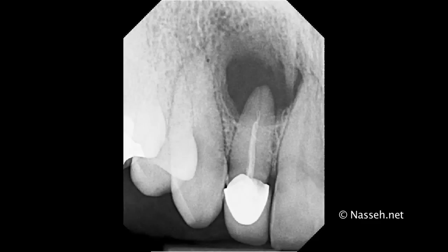Hello, this is Alan Nassib with another quick tutorial of an interesting case of a combined retrograde and orthograde filling of an anterior tooth number 7 with a large periapical lesion.